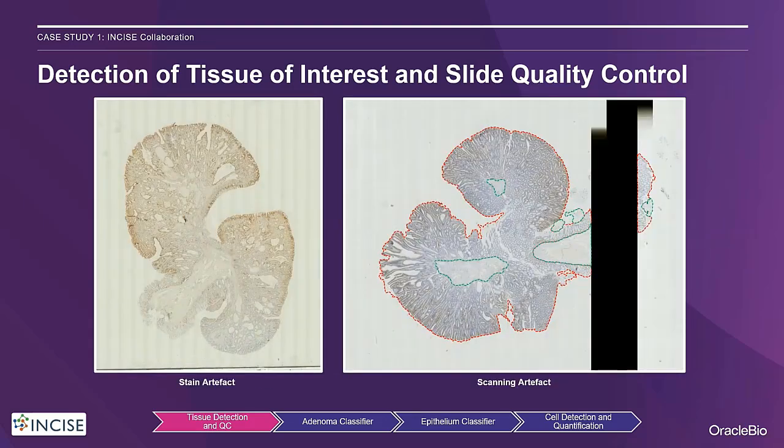So in terms of quality control, in a small-scale study with a few dozen images, checking every single image for large, obvious artifacts is something doable, but not here. When you are faced with thousands of samples, this initial screening needs to be robust and needs to pick up major artifacts that will impact any analysis further down the line. So for example, on the left here, we had some samples that had no hematoxylin stain, probably due to an issue with the autostainer, which means our cell detection app further down the line would not have performed as it should have. So images like this with bad stain distribution are picked up and removed in this step.